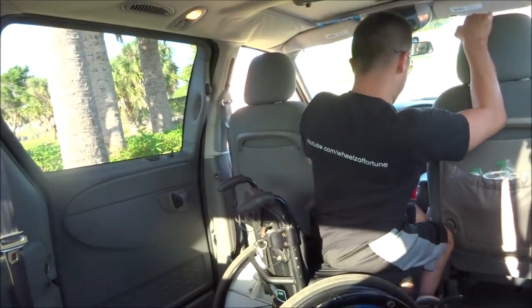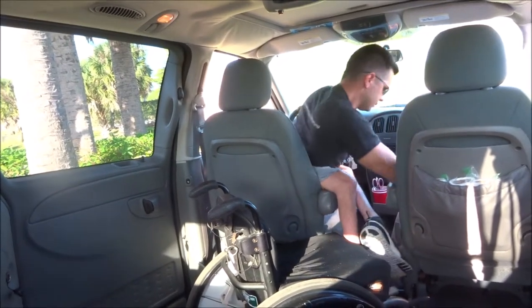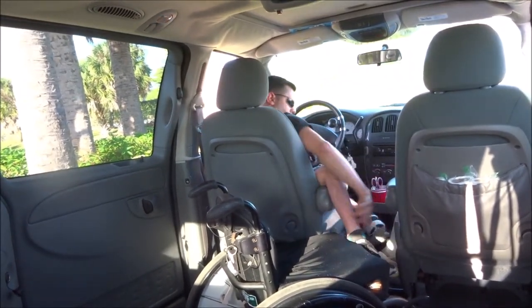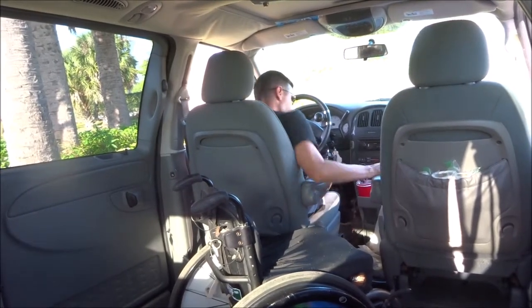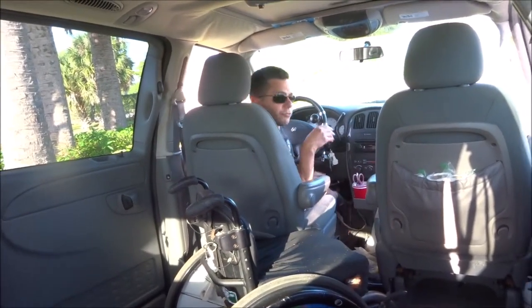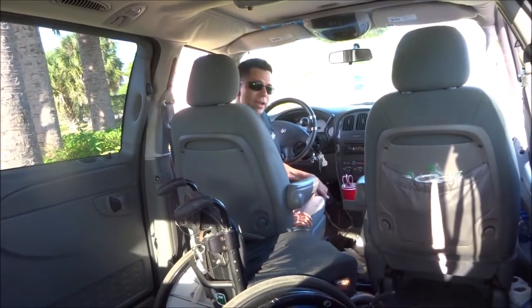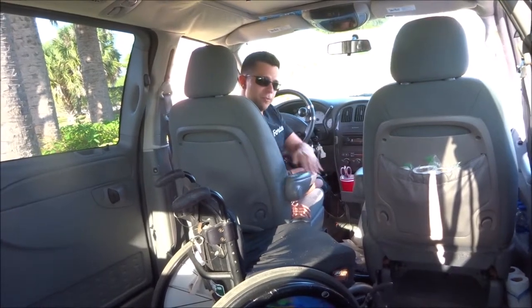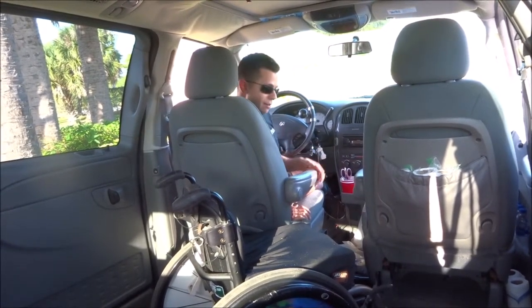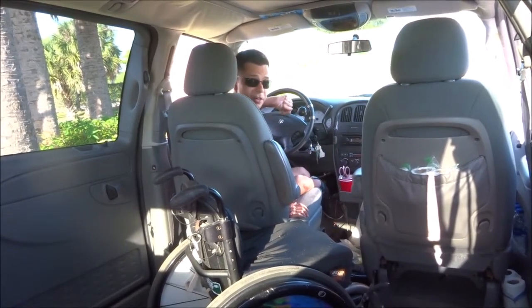Transfer into the driver's seat. Now if you noticed, I put the armrest down when I transferred in — that's because it makes it just a little bit easier for me to transfer in. When I'm driving, I keep the armrest up because otherwise it impedes my ability to steer.